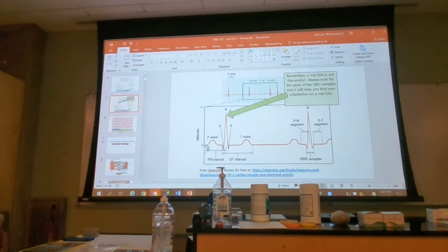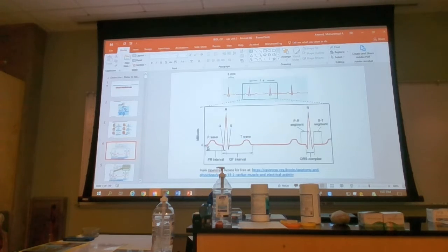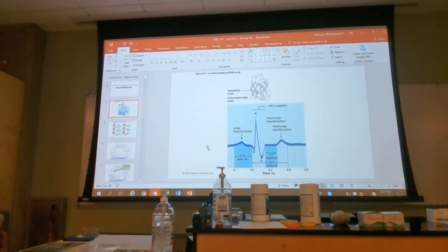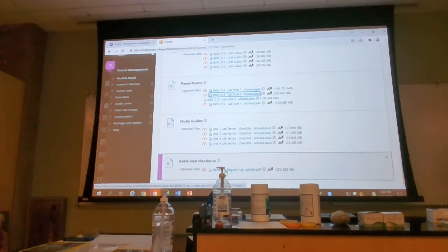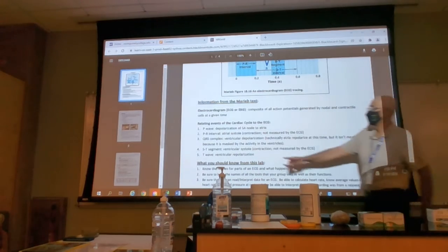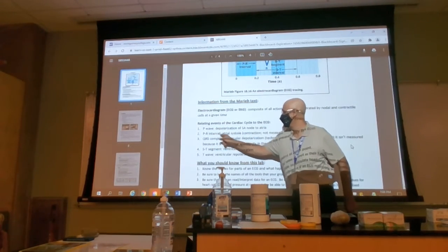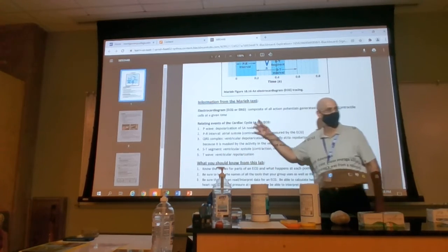And again, it's all written here, right? Oh, it's on the second slide. Oh, but the definitions I'm saying. The definitions are explained in the lecture, or you can see them here also. Look at this handout here. That says EKG handout. They're all defined here, Mohammed. You should be able to tell what P wave stands for, what PR stands for, what QRS stands for, what ST stands for, what T stands for. You have all this, right, guys?